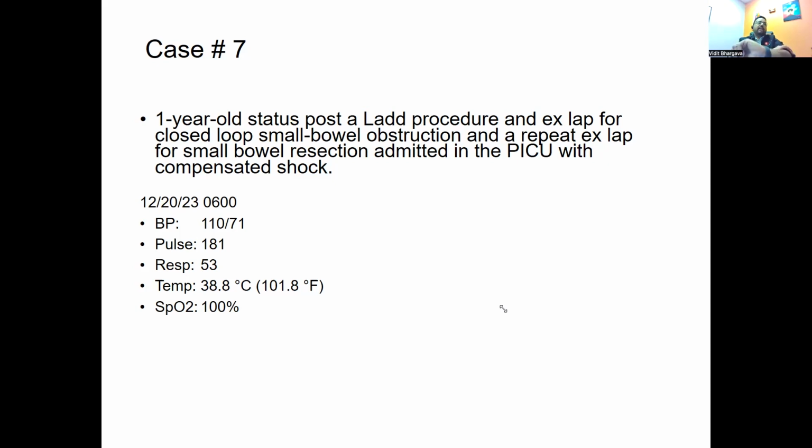Yeah. I think this is a little bit different from how you use dynamic guidance for an effusion. With an effusion, you can see your pocket of fluid, and you can try to enter the largest pocket so you have a margin of safety. If I'm understanding correctly, you're asking how do you ensure that you can tap the pneumothorax without causing a bronchopleural fistula by injuring the lung?